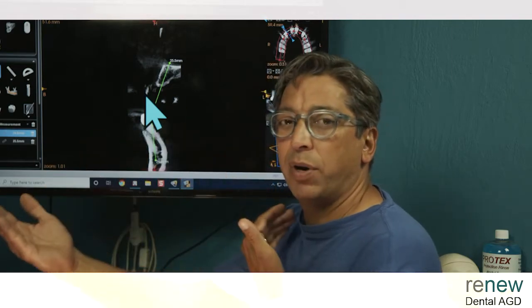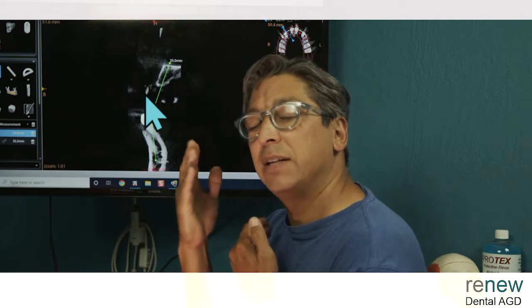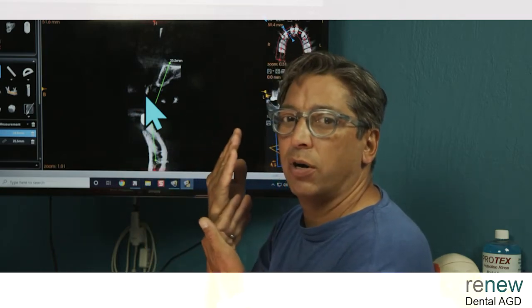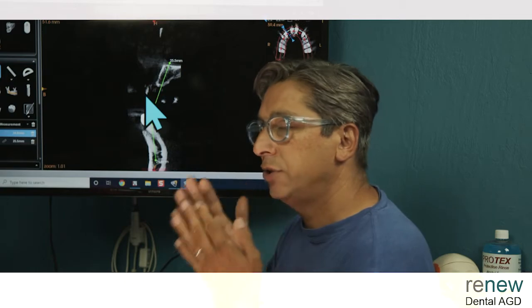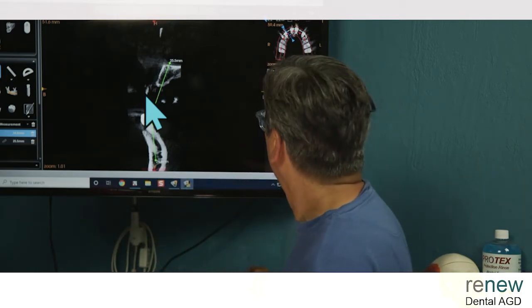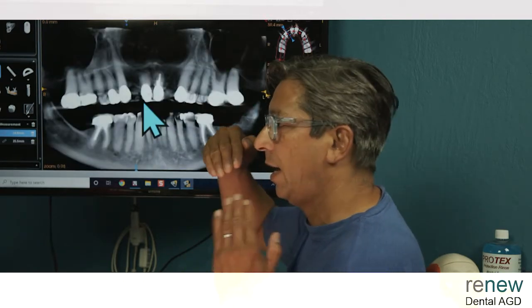You're going to have to forget about where his natural teeth were and put the prosthetic teeth inward. It's not exactly what patients are expecting, but you're going to have to really bring them in. It does change the way they look. It certainly changes the way they feel. But there's no other way you can get a balanced bite out of it.